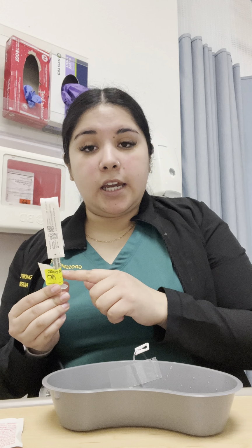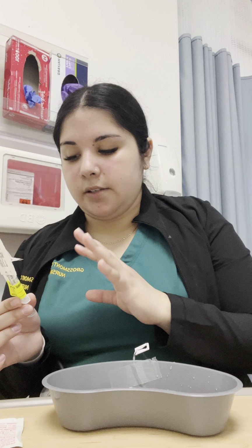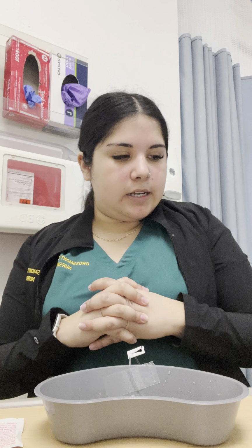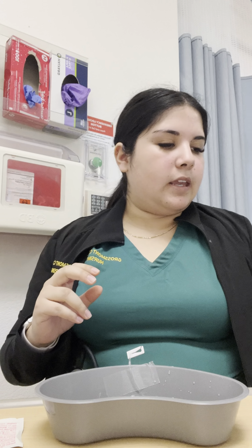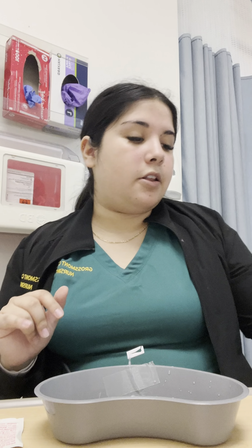I have labeled my syringe with the medication, the dosage that is in here, and my initials and the date as well as the time. Having done all my checks and all my pre-assessment, I will now look at the IV site and look for any redness or swelling, any signs of infiltration. And I will also pause any infusions that are running. In this case, there was no infusions running and there's just a saline lock.